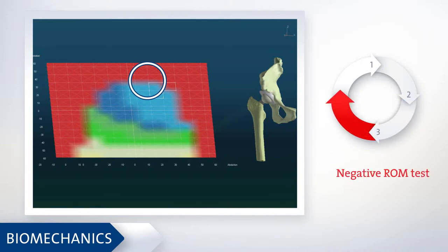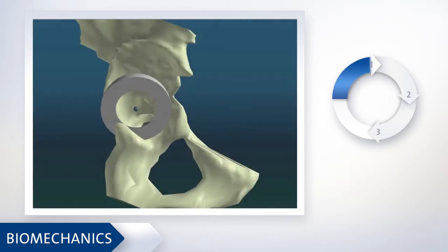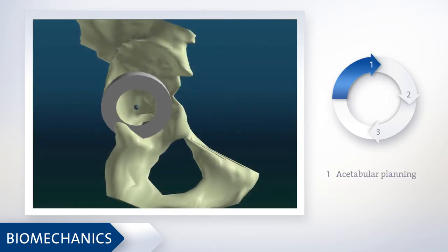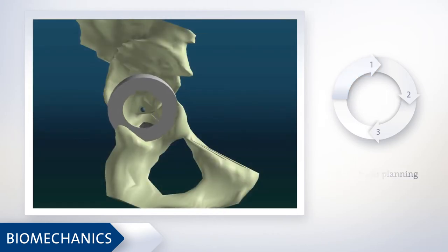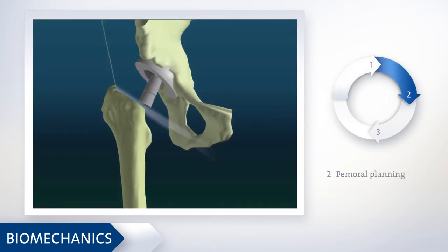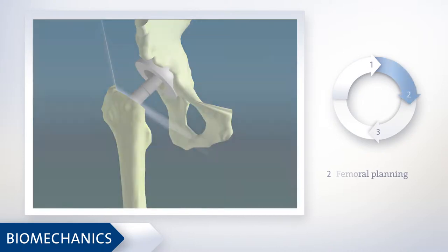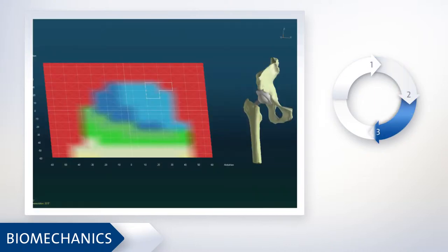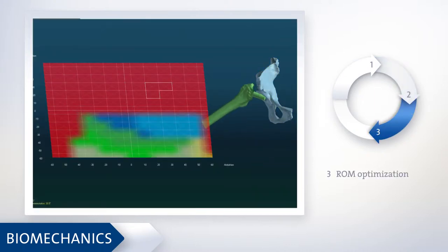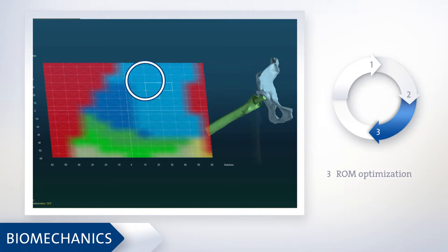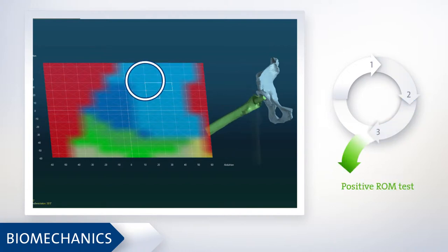In case of a negative ROM test, reconstruction is revised and refined. As soon as the best possible range of motion has been achieved, this step has been completed successfully.